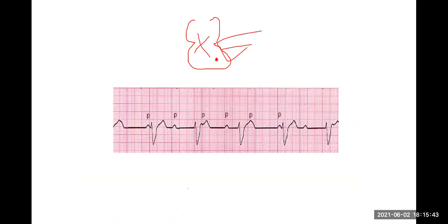That is not a tachycardia, that is an escape. It just barely works; it starts working. But we already know by definition, if there is a current starting in the ventricle, what happens to the QRS complex? It is abnormally shaped. So the escape rhythm also has a broad abnormal looking QRS. The only difference from ventricular tachycardia is that this is much slower, maybe about 30, or 30 to 40, or sometimes less. Very slow.